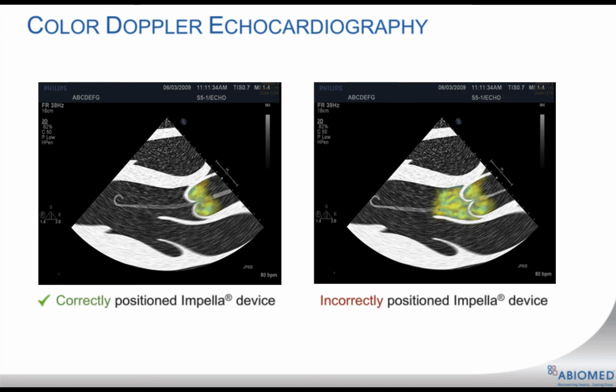If the outlet area of the Impella catheter is too close to the aortic valve, colored Doppler echocardiography reveals jets of blood, creating a mosaic pattern in the left ventricle which resembles aortic insufficiency. Closer inspection, however, reveals that the outflow is occurring at the valve, which may be directing blood beneath the valve. An Impella catheter in this position can trigger a blocked outlet alarm, and the high shear forces on blood ejected into the aortic valve leaflets in this way can damage blood cells.